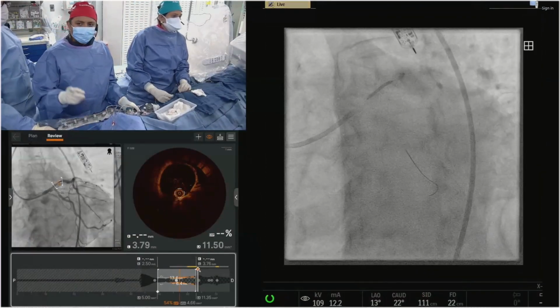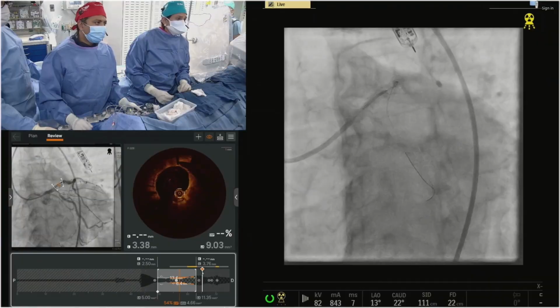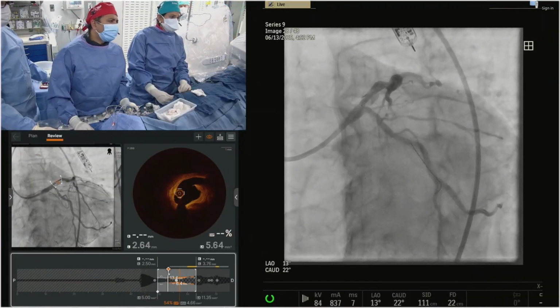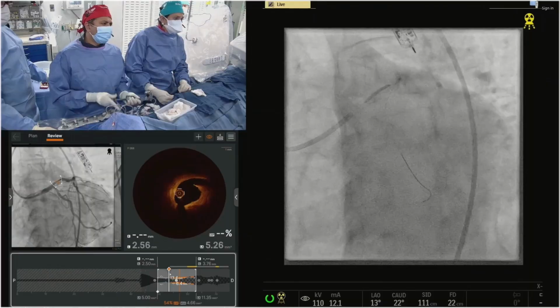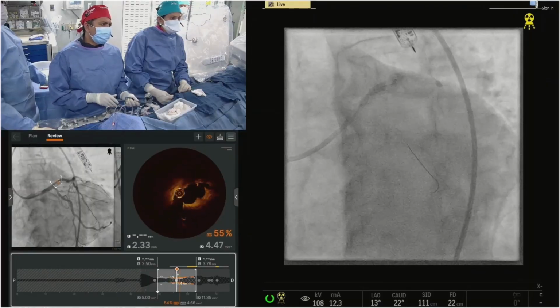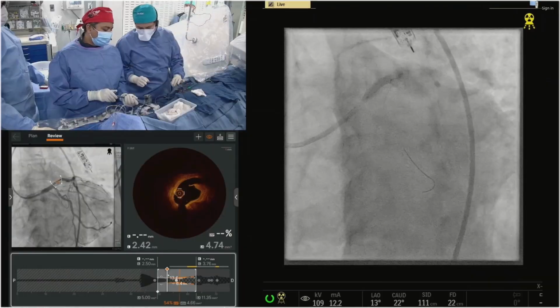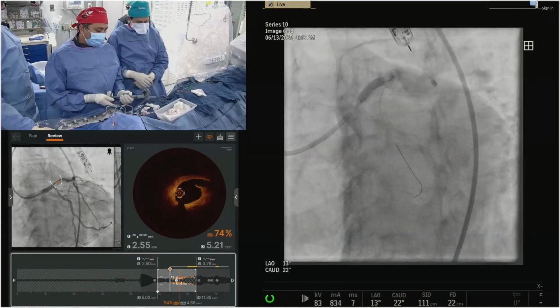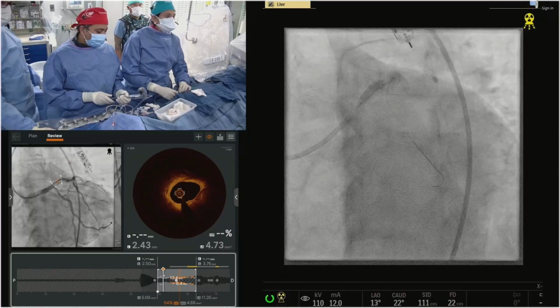See if we can cover the whole 3.5 thing, and then make it bigger if you need to. Oh, wow. Really bad. Okay, go up. I think you're right. You're good. 90-year-old tissue, you know. Don't go to 18. We did not. Now we are 12. We've got the right size. Is the papyrus ready? Yeah, the papyrus is ready.